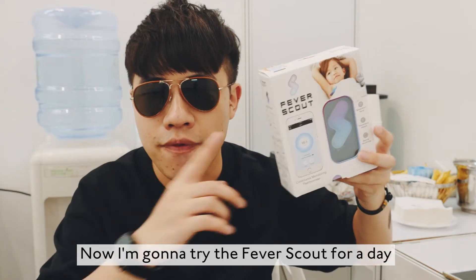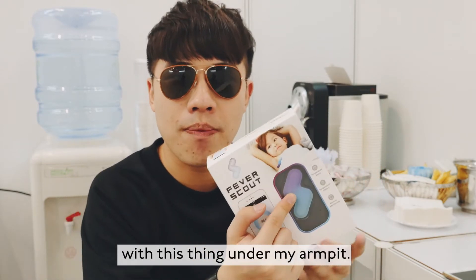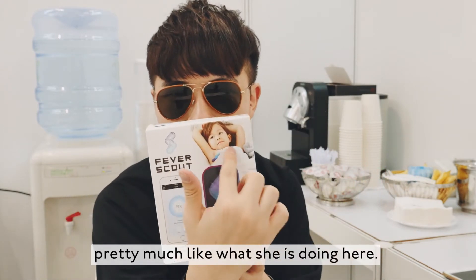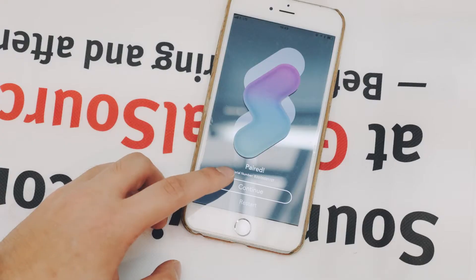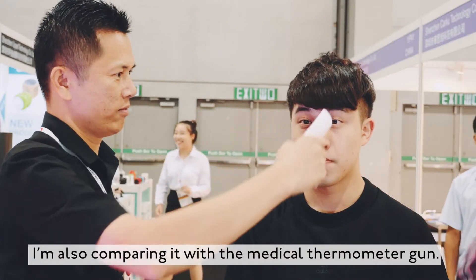Now I'm going to try the Fever Scout for a day — just 24 hours non-stop with this thing under my armpit, pretty much like what's shown here. I'm also comparing it with a medical thermometer gun.